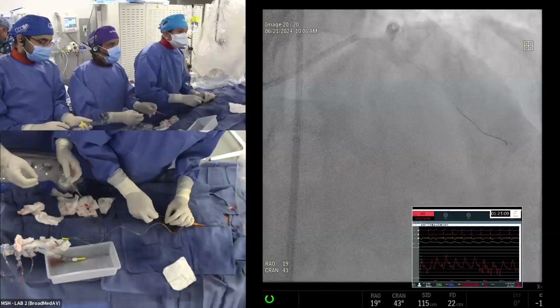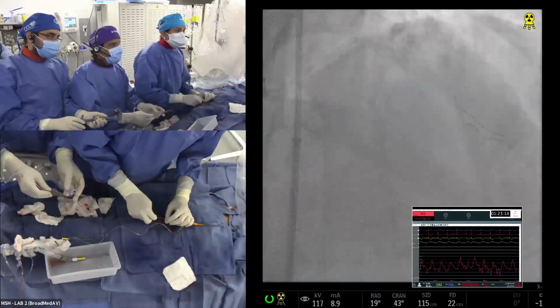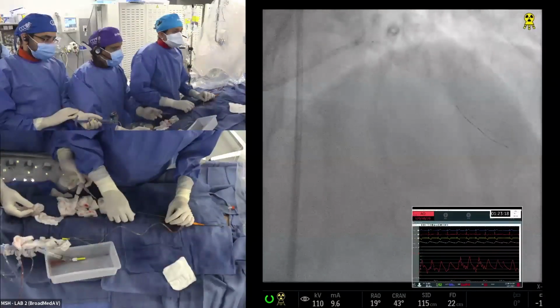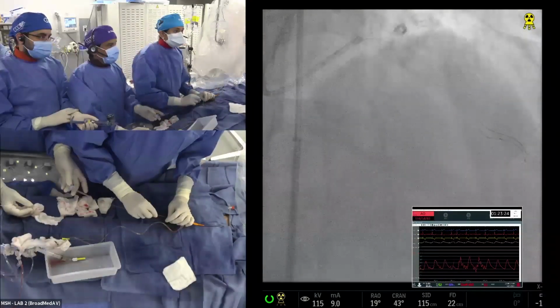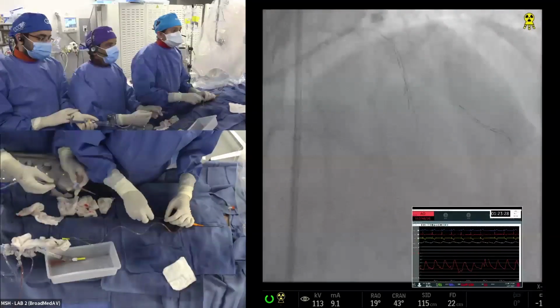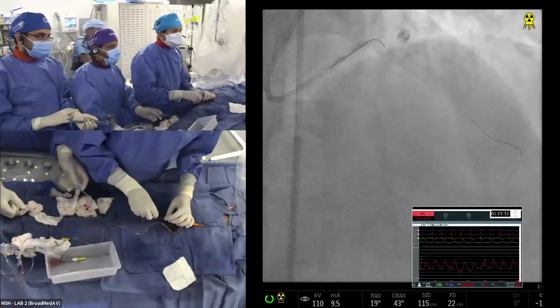The question is whether 2.5 will do anything to this lesion, but I think the lesion is quite significant. Even IVUS had trouble at that place, remember, to go in. Yeah, despite rota. You see that? You want to open it here? No, I want to do little low pressure. So anything? Okay, take the wire back. Wire back and rewire it.